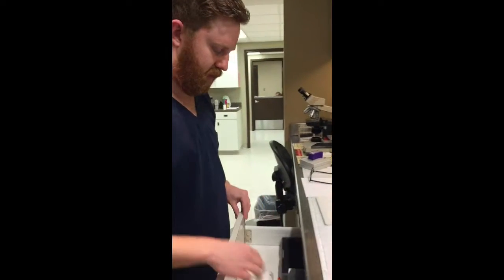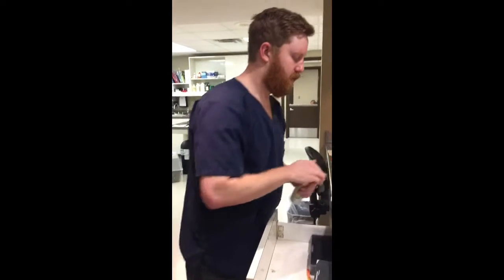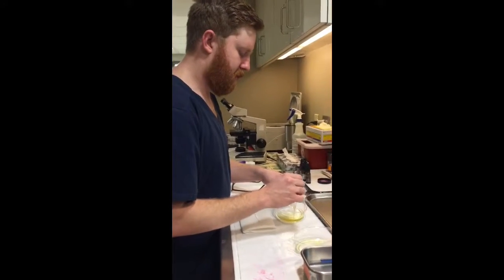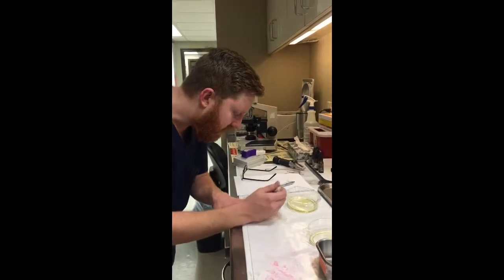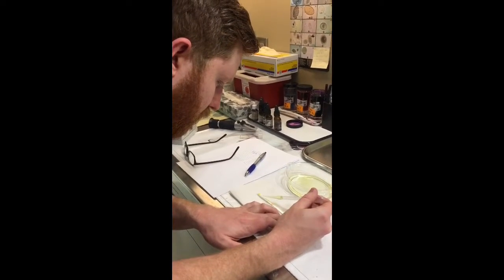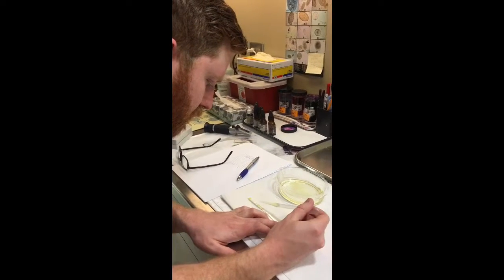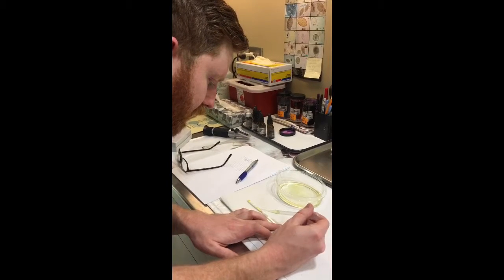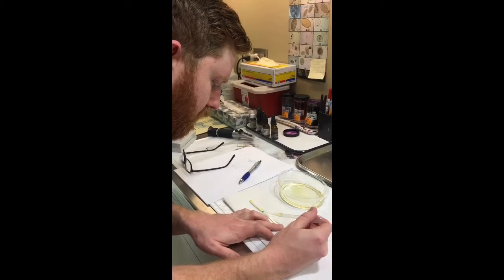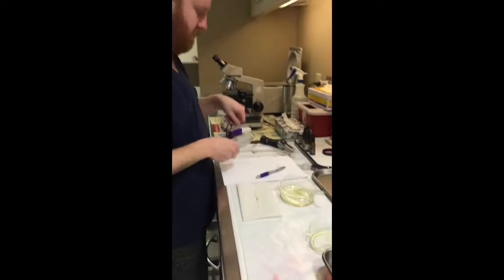Okay, and I'll go ahead and get my chem strip out. This is the chem strips we use at Riverview Animal Clinic. I'll use this pipette to carefully place it on each area here without cross-contaminating or touching it. I've got it on a paper towel just to prevent a mess here. Okay, I'll let that set just a second.